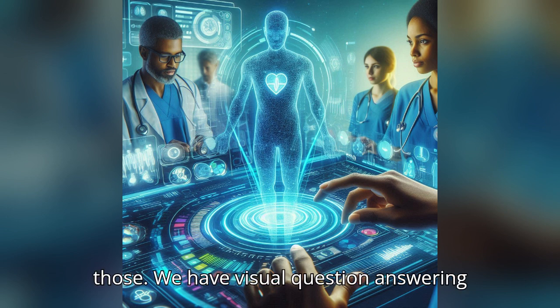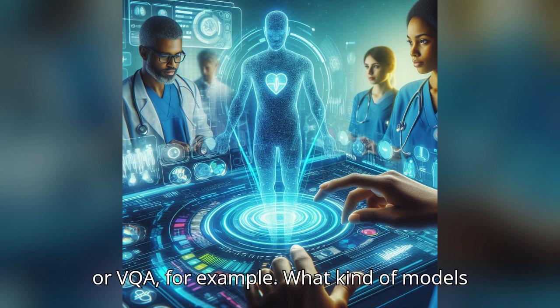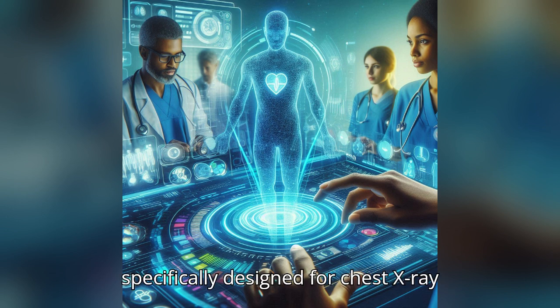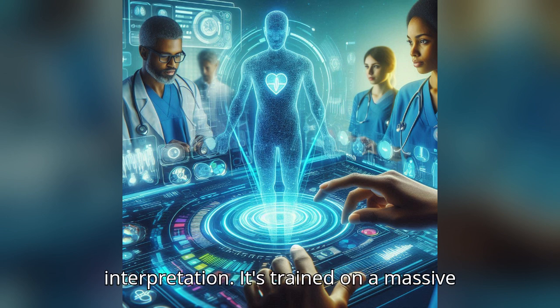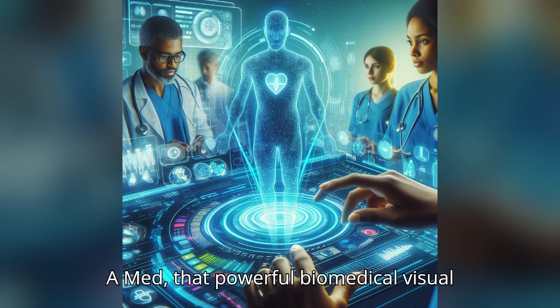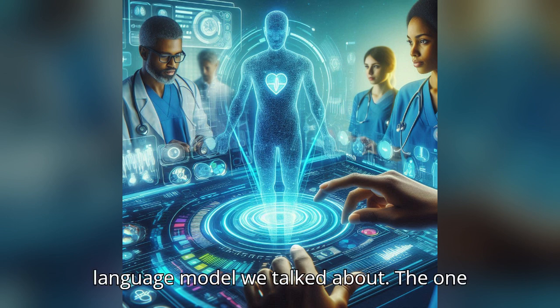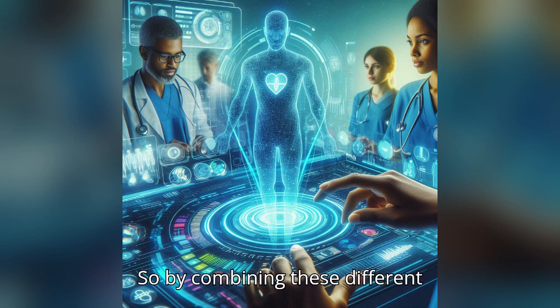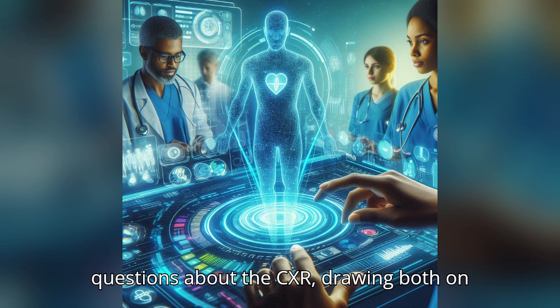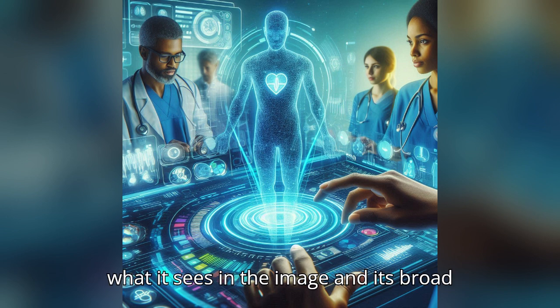Yeah, let's get into some of those. We have visual question answering, or VQA, for example. What kind of models are being used for that? So for VQA, MedRax utilizes models like ChestAgent, which, as we mentioned earlier, is specifically designed for chest X-ray interpretation. It's trained on a massive data set of chest X-rays, and it's really good at understanding those visual nuances that are so important in this context. MedRax also incorporates LLaVA-Med, that powerful biomedical visual language model we talked about, the one that's really good at zero-shot learning. So by combining these different approaches, MedRax can answer open-ended questions about the CXR, drawing both on what it sees in the image and its broad medical knowledge.